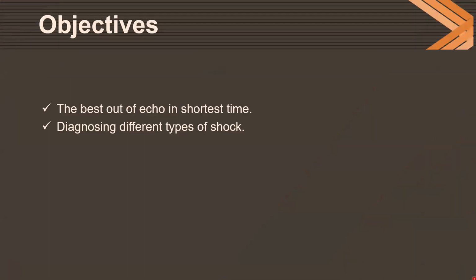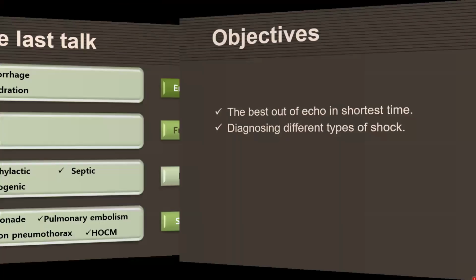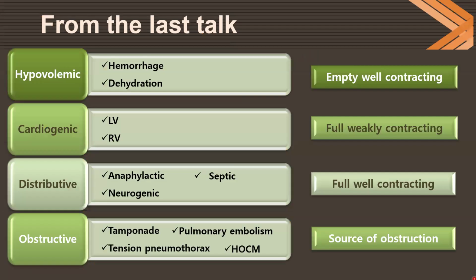By the end of this talk, I will discuss how to get the best out of echo in the shortest time, diagnosing different types of shock. This is a continuation of my talk about the pathophysiology of shock.